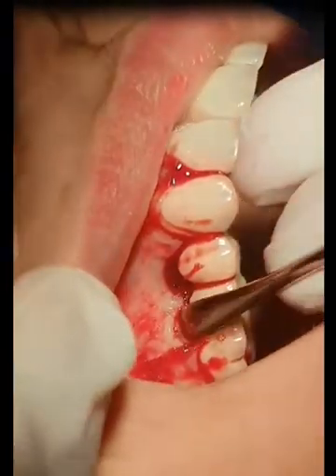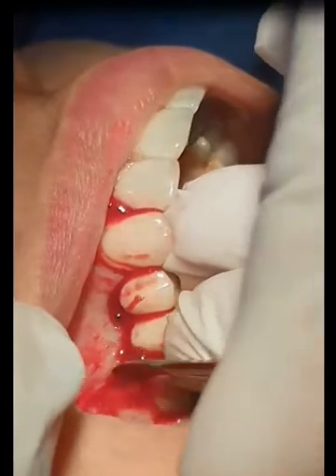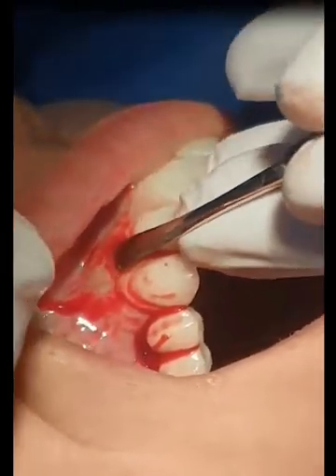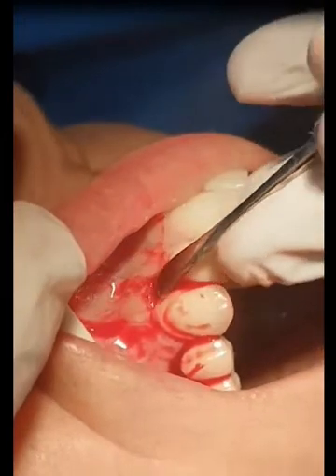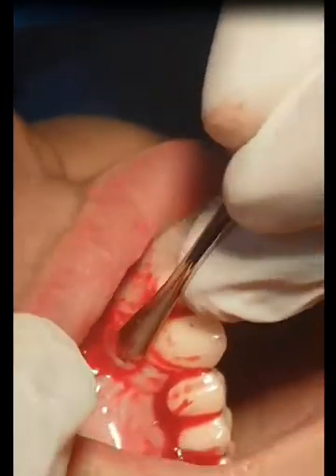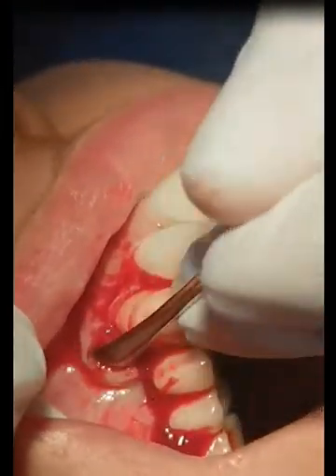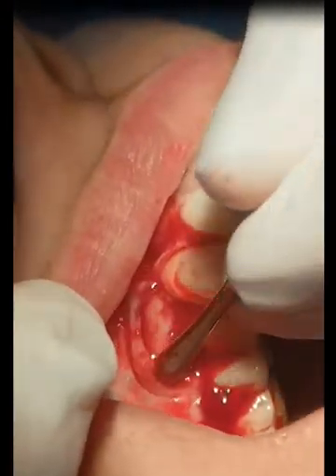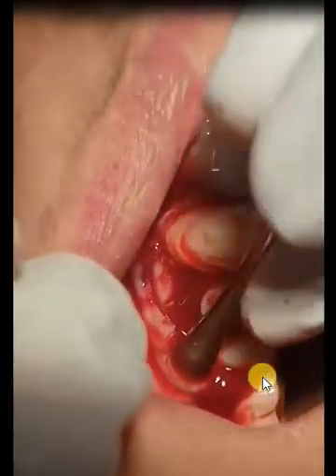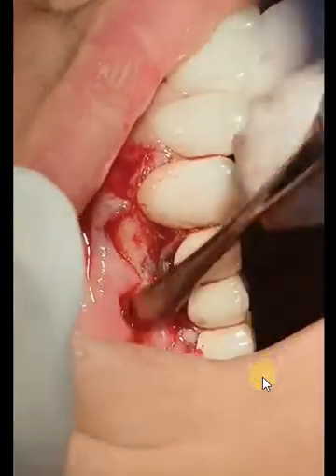A removable appliance should be used for two weeks or more to avoid post-operative trauma to the surgical site. The wound closure should include interrupted sutures and mattress sutures to both stabilize the bone graft and PRF, as well as stabilize the edges of the flap. Horizontal mattress is used for stabilizing the bone graft and PRF, while simple interrupted is just for closing the edges of the papilla.